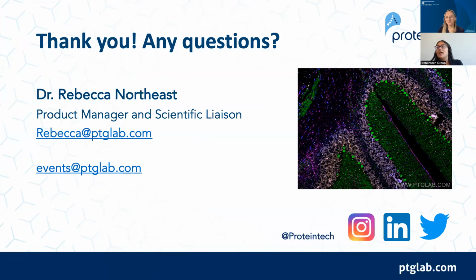So Maria is asking, how would you adjust an IF protocol to visualize surface proteins and intracellular or transmembrane proteins? Yeah, that's a really good question. And I think, unfortunately, there isn't a simple answer for that, but I think it depends on the intracellular protein and the extracellular protein that you're looking at. But I would definitely first start with the fixative, see which one works for you, you could try them individually.